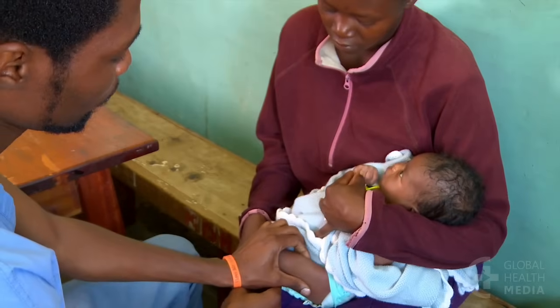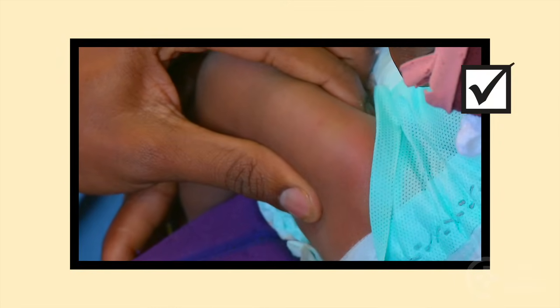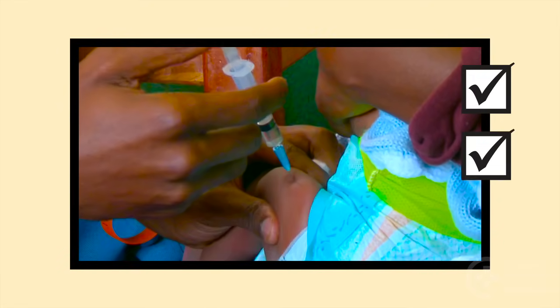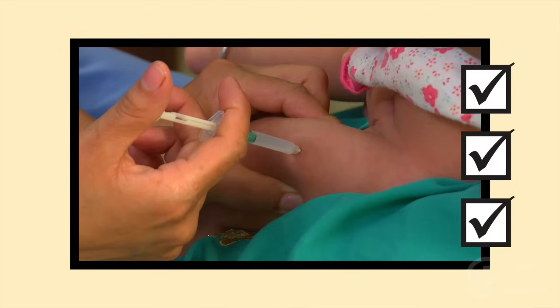Remember: an IM injection goes in the outer thigh of the baby. The injection goes straight in. A quick, darting motion is less painful.